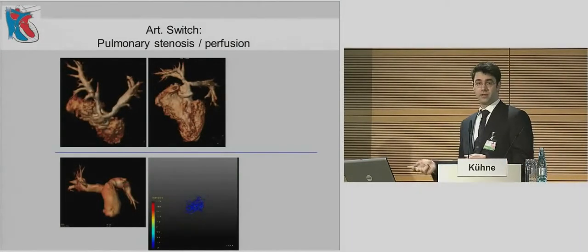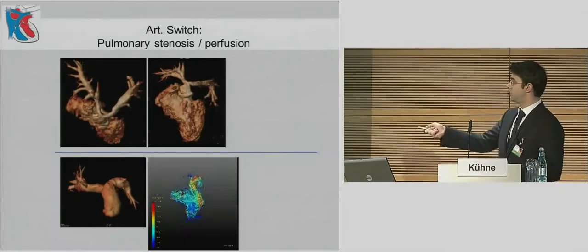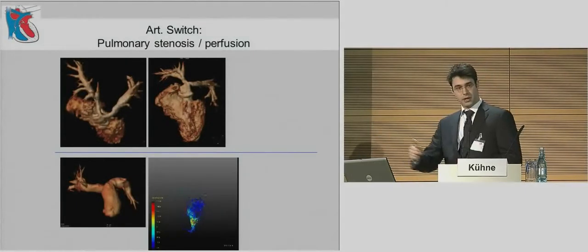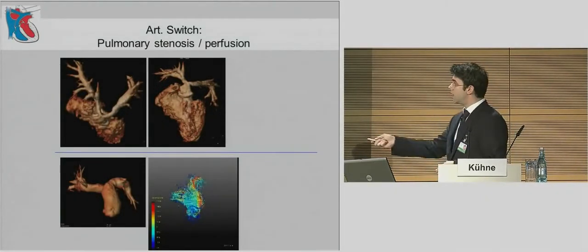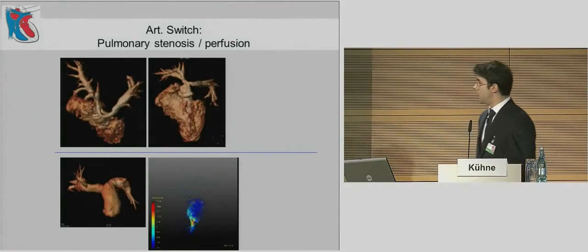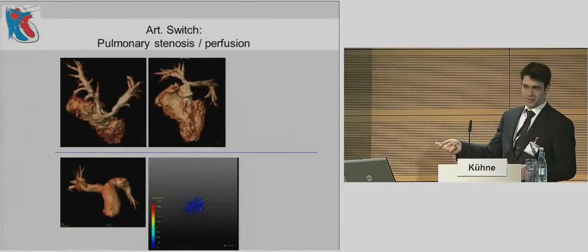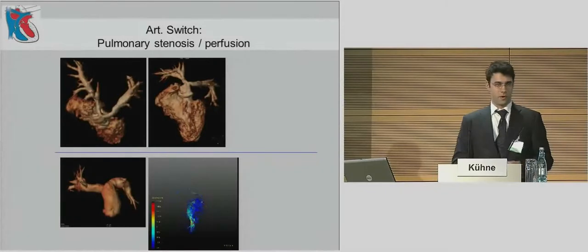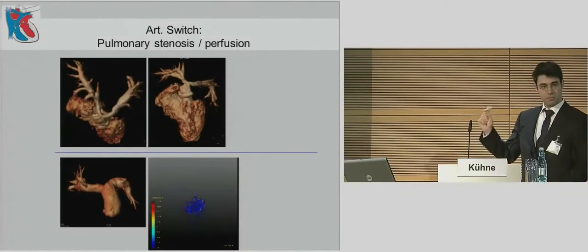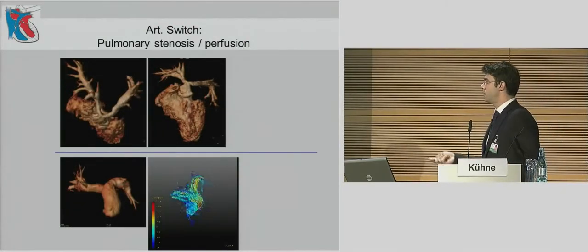But even if the vessels are not thin or, let's say, stenotic, we have funny situations like this, for example, where we have a pretty steep angulation of the right pulmonary artery and a not so steep angulation of the left pulmonary artery related to the main pulmonary stem. And now look at this 4D. It's maybe a tool for the boys, because we have only a pretty image now, but maybe let's talk about that later, also some helpful information.